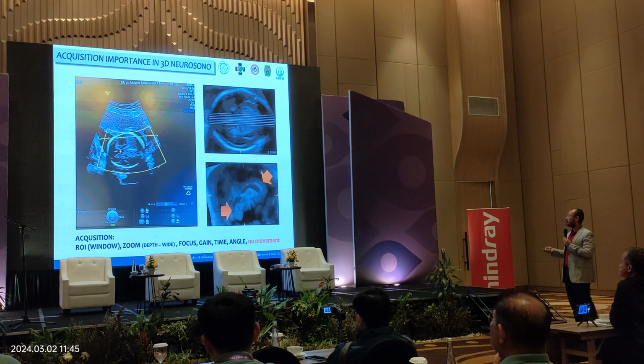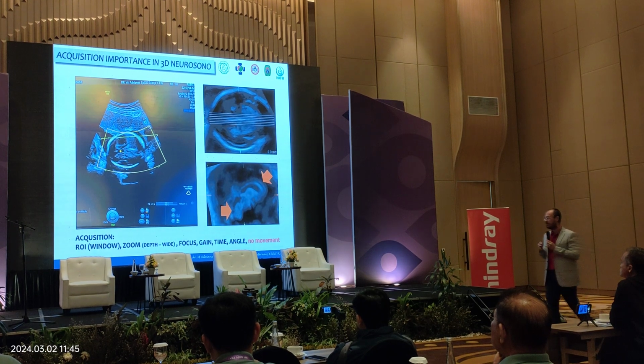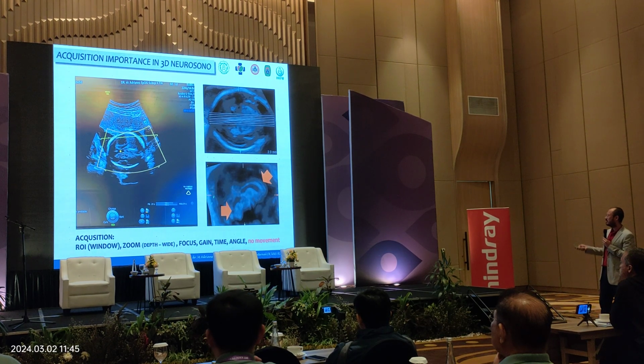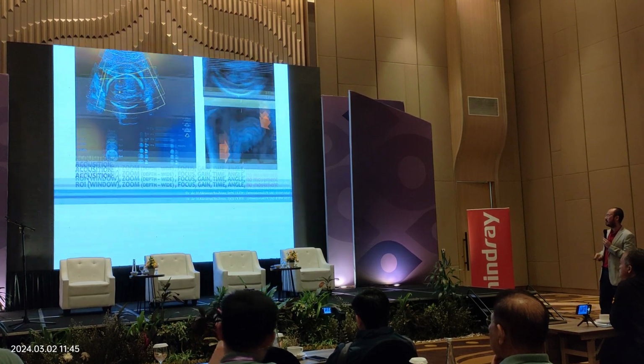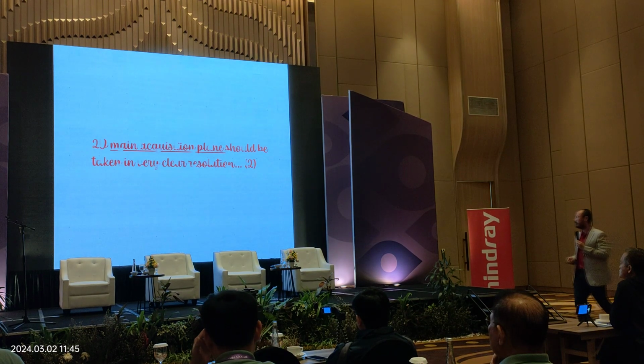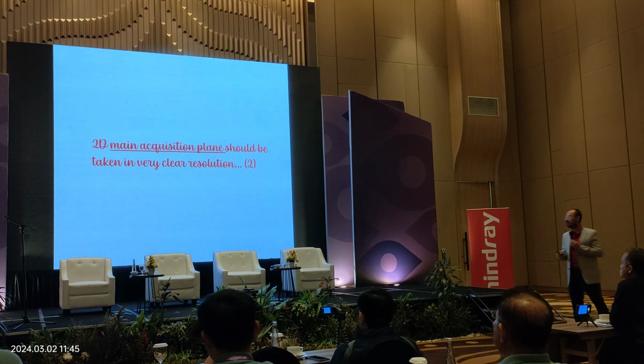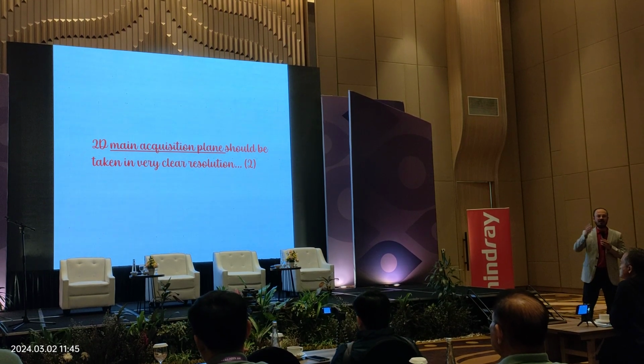Okay, this one is the acquisition window. The region of interest should not be very broad, but also not very tight, so that we can appreciate the target organ that we want to see very clearly, like here the falx, the corpus callosum, and we can also measure the angle and so on. So the 2D main acquisition plane should be taken in very clear resolution. This is very fundamental.